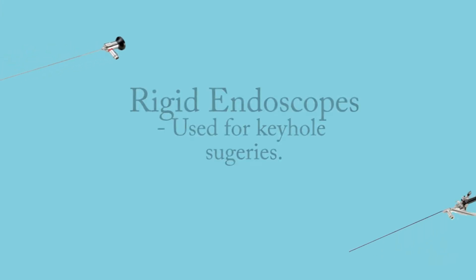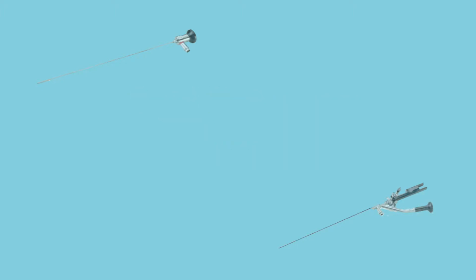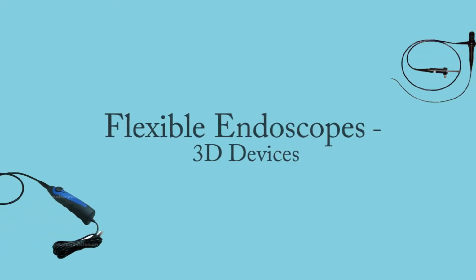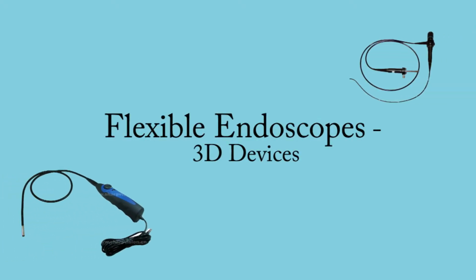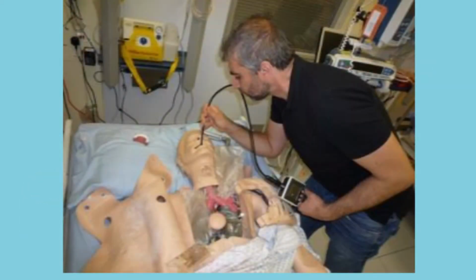There are different forms of endoscope devices. There are rigid endoscopes that are used in keyhole surgeries. And there are flexible endoscopes which are predominantly used within 3D devices. The flexible endoscopes are becoming more popular due to the ease of navigation through the patient's body. The camera mounted upon the end of the flexible tube will enable the surgeon to explore inside the body much easier than a rigid endoscope.